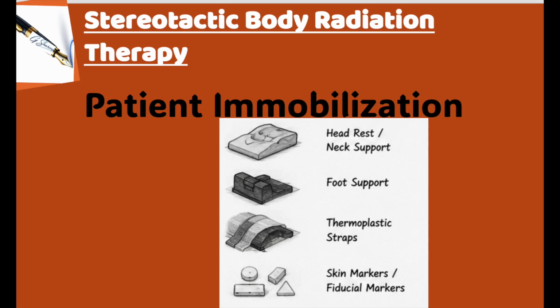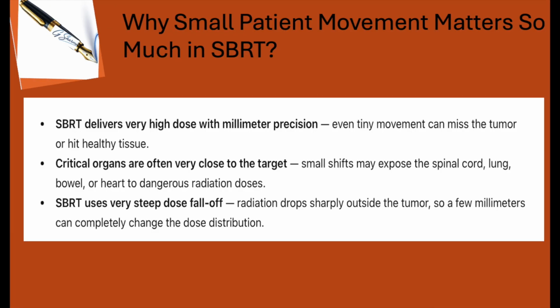That is a different topic and I'm not going to explain it here. I discuss SRT techniques at that time, and I discuss many immobilization devices over there. Sometimes I tell students that in SBRT, even a small movement can make a big difference. That's why the immobilization process is very important.